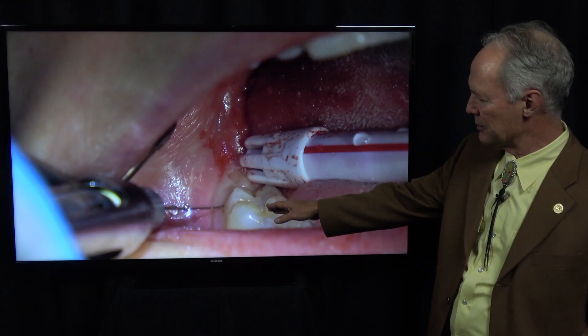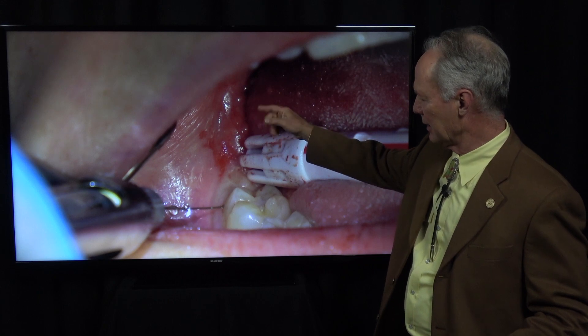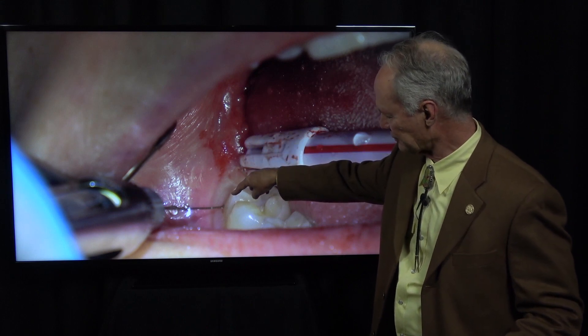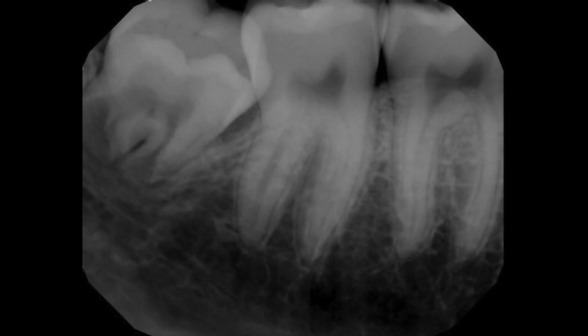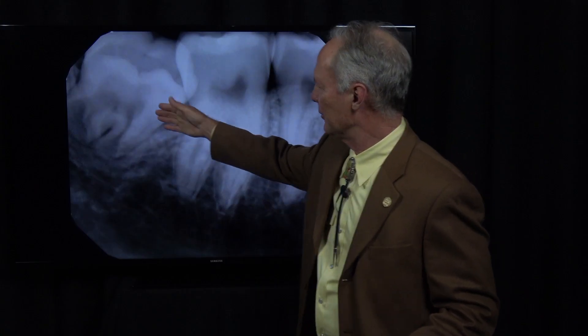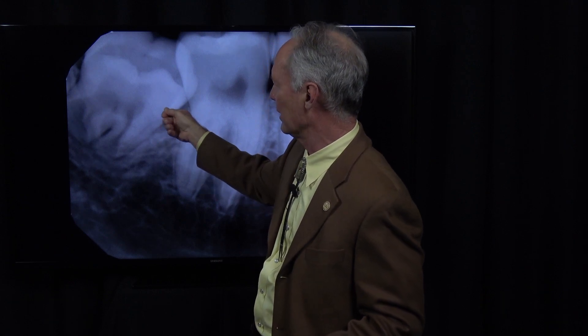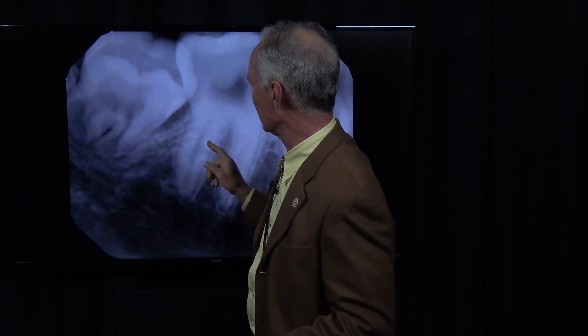Now this is the lower right wisdom tooth. I've given the nerve block along with the long buccal, and then I'm giving the intraligamental injection to completely numb that lower right wisdom tooth. I'll either be able to elevate it if there's enough space on the distal, but I'll probably not be able to elevate it straight out without removing some tooth structure because it's impeded by the second molar.